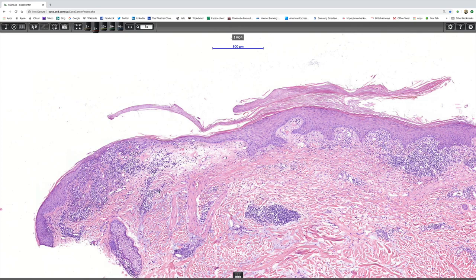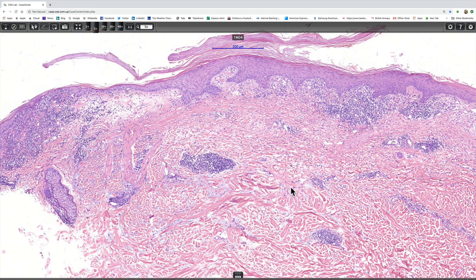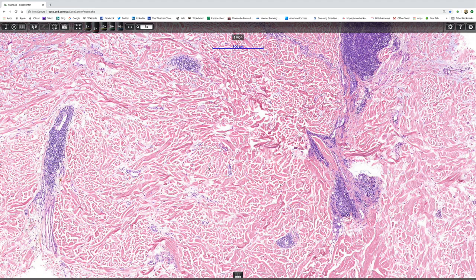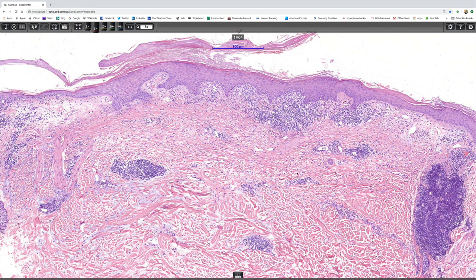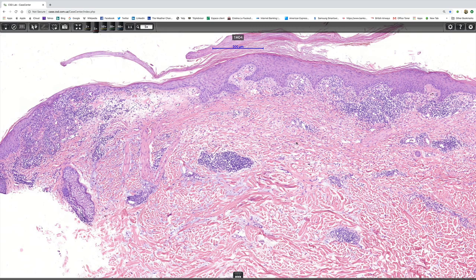I want to just go back to low power to see if we can see any follicular plugging. In this particular section, unfortunately, the hair follicles are not well displayed. But you can notice a heavy perivascular superficial and deep infiltrate, which is something you expect to see in lupus. It's also periadnexal and typically involves the hair follicles, in which you do get very marked follicular plugging. Clinically, if you dare to raise the scale, you'll see that the follicular plugs adhere to the undersurface of the scale — this is called the carpet tack sign.